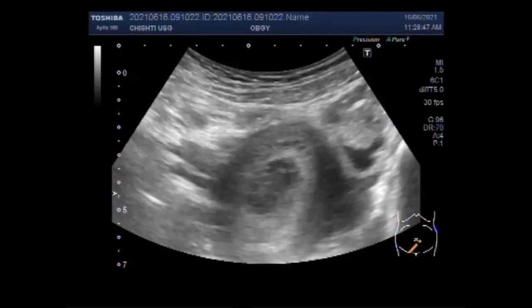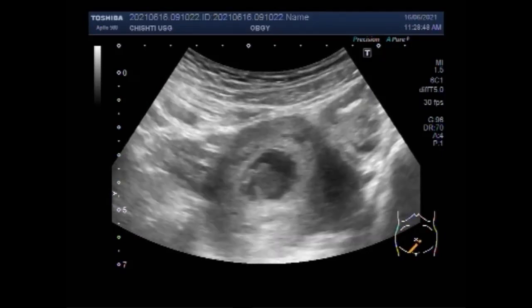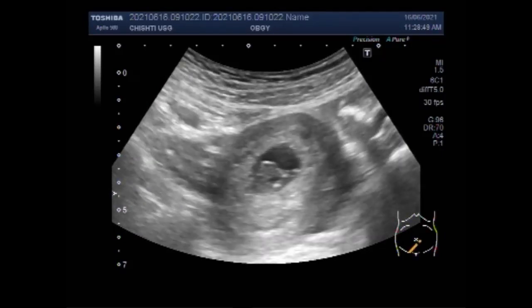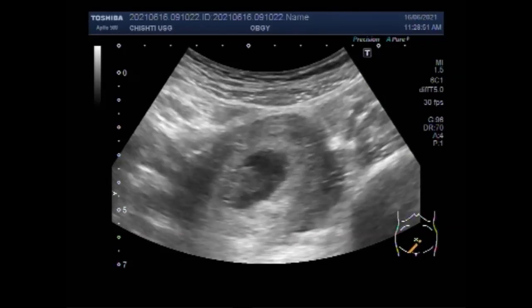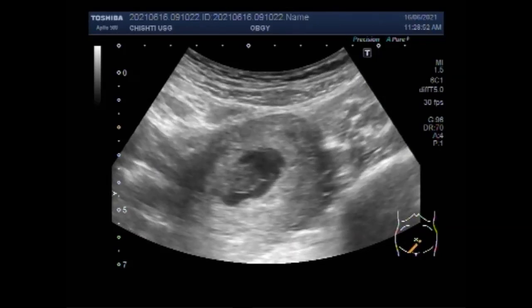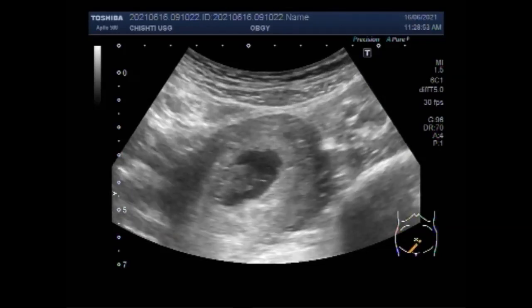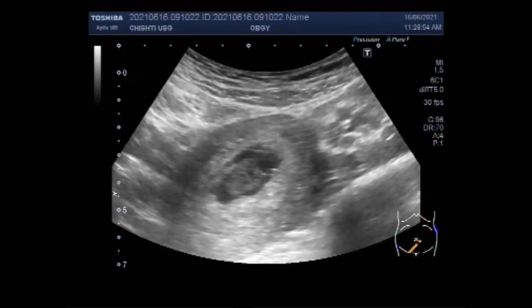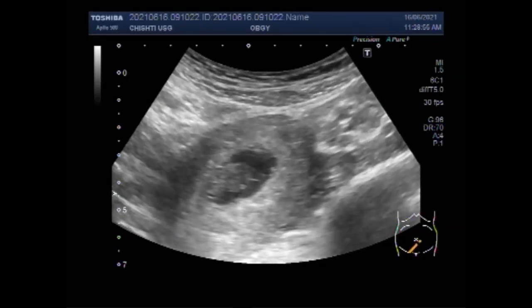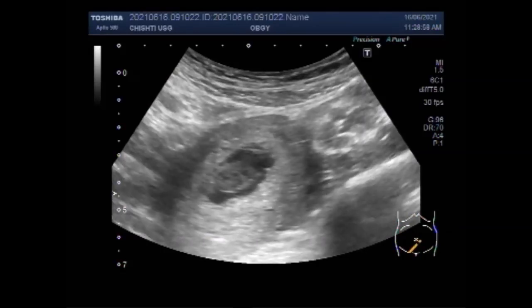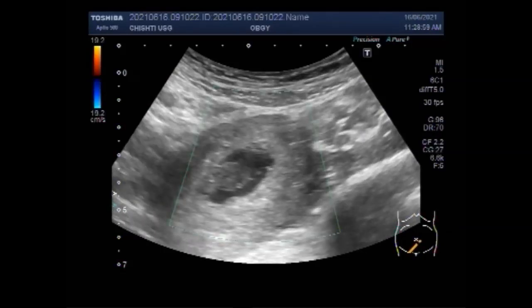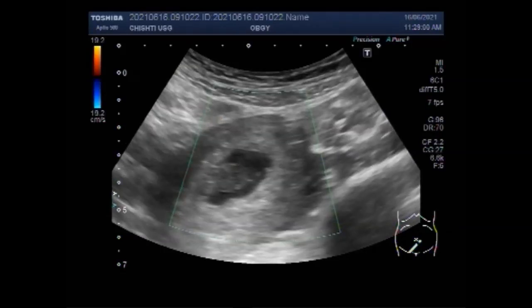Now again you can see the uterus having a fetal pole with no cardiac activity. No blood flow is seen in the fetus.